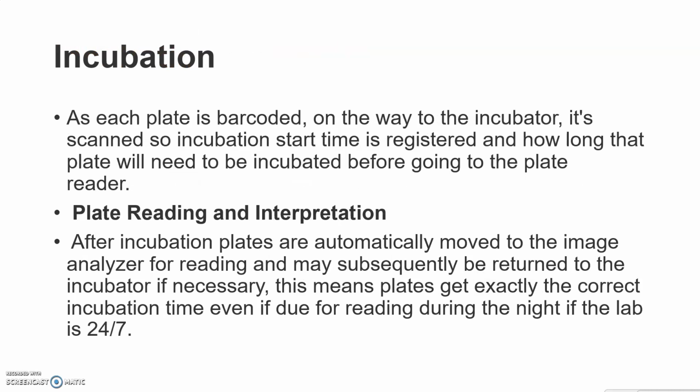Incubation. As each plate is barcoded on the way to the incubator, it's scanned so incubation start time is registered and how long that plate will need to be incubated before going to the plate reader. Plate reading and interpretation. After incubation, plates are automatically moved to the image analyzer for reading and may subsequently be returned to the incubator if necessary.